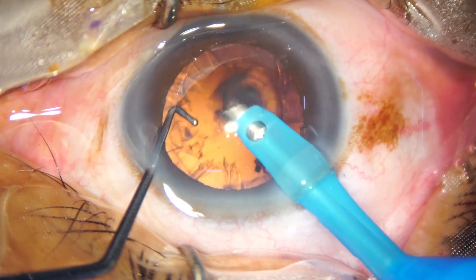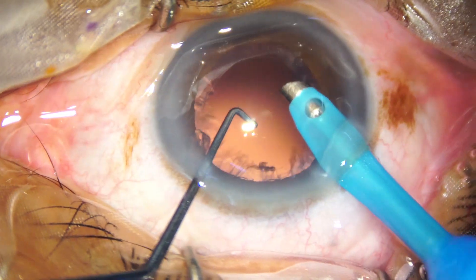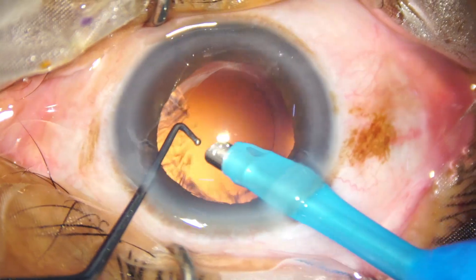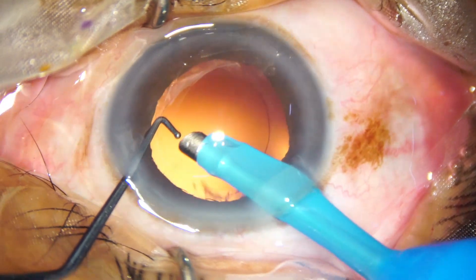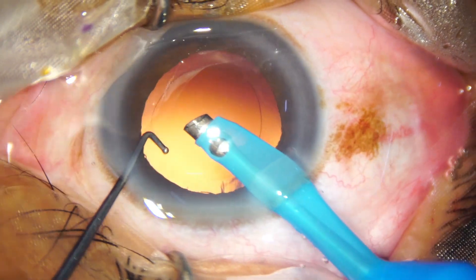Once the epinucleus is removed, please come out and remove the cortex with safer instruments like bimanual or coaxial irrigation-aspiration. This may not be safer in many people's hands.